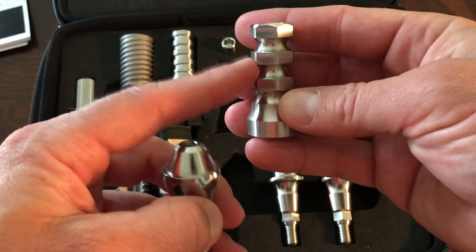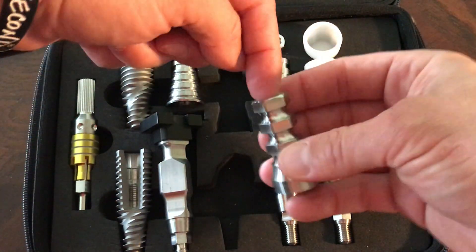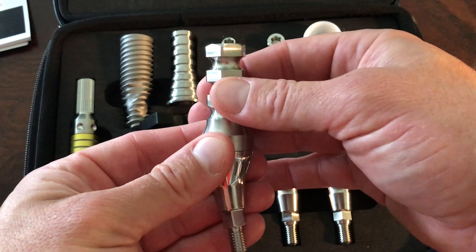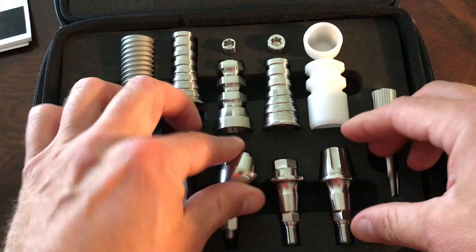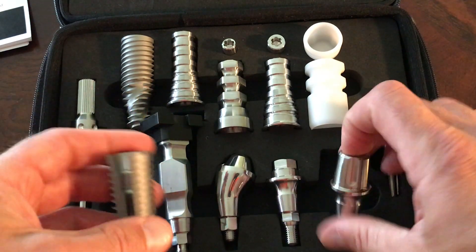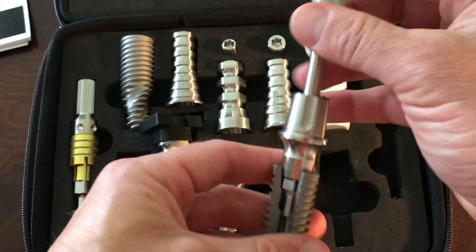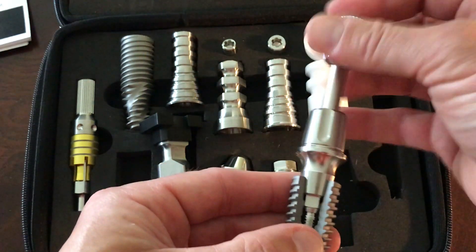And even this — this is actually the impression coping for an open tray. I don't have the post that slides down the top, but now not only can we use this as a pickup for an open tray, but if we need to, we can even clip and use this as a temporary. Another really big feature is when we place our abutments and draw them down into the hex.